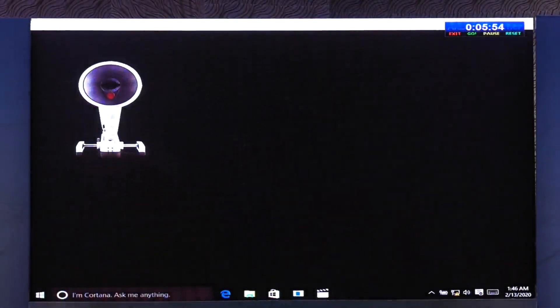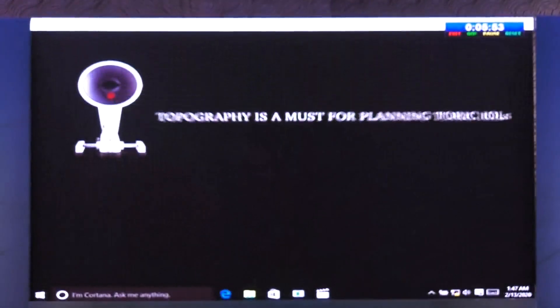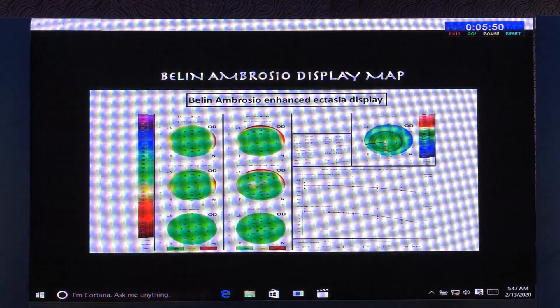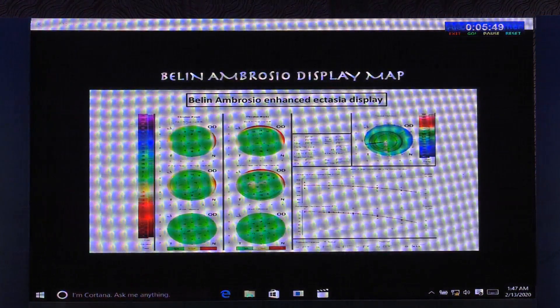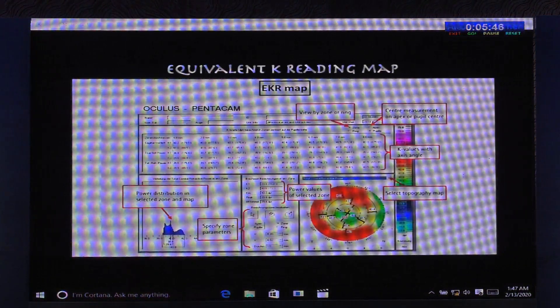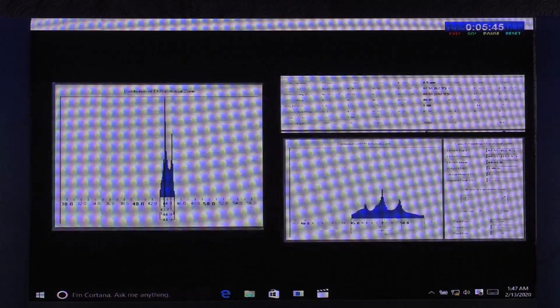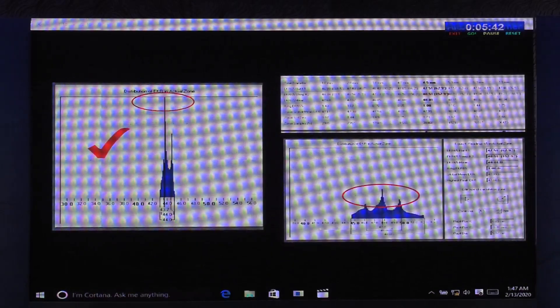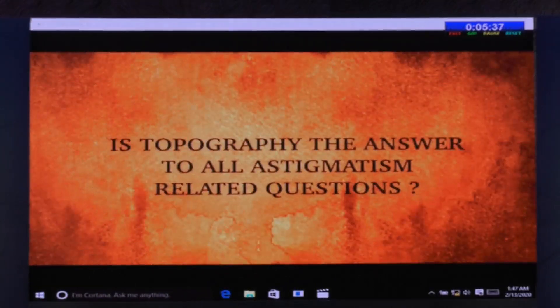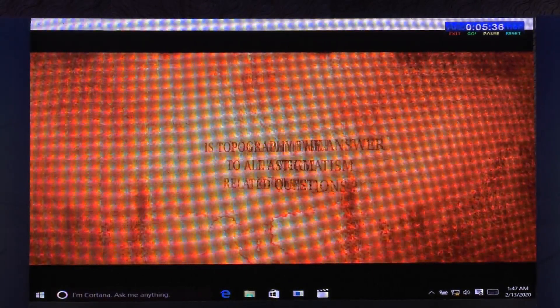Thus, an accurate reading of topography with knowledge of the Belin-Ambrosio display map and the EKR map helps in planning precise toric IOL implantation. But is topography the absolute answer to all our questions?